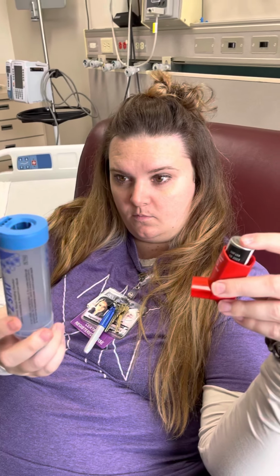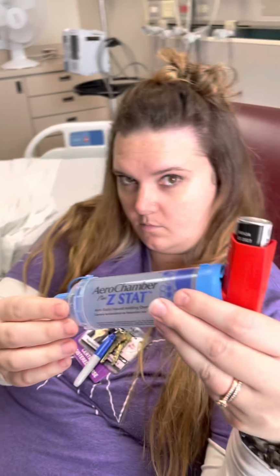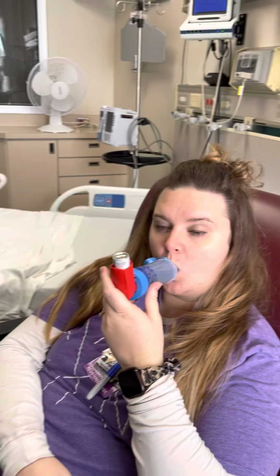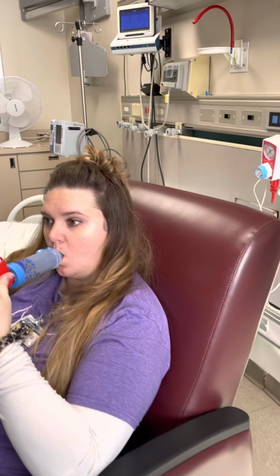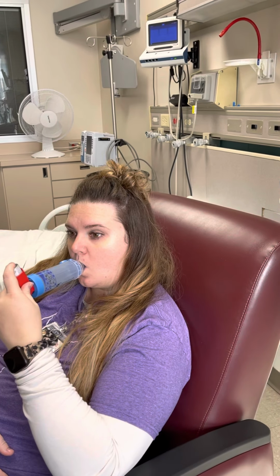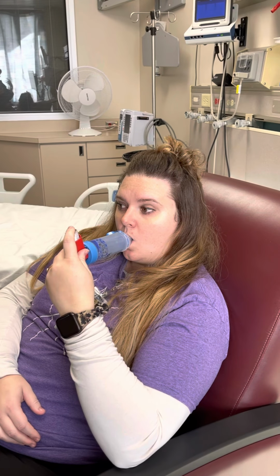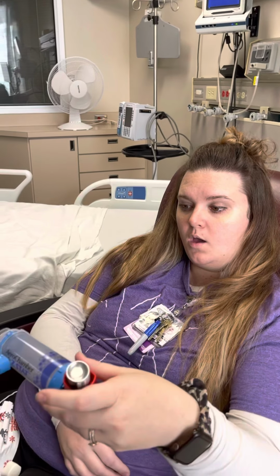If your patient is going to be using a spacer, which is available in the respiratory supply closet, it's going to look like this and come in a plastic wrapper. You take it out of the wrapper. This back hole right here is where you fit in your inhaler, and then take the mouth guard off. Same protocol. You're going to have the patient exhale everything out of their lungs, put the mouthpiece in and tightly seal their lips around it, and then depress the medication plunger to expel the medication. And then they're going to breathe slowly and deeply 3 to 5 times to inhale the medication that's in the canister. They don't have to hold their breath at any time. When they take it back out, then they can just breathe normally.